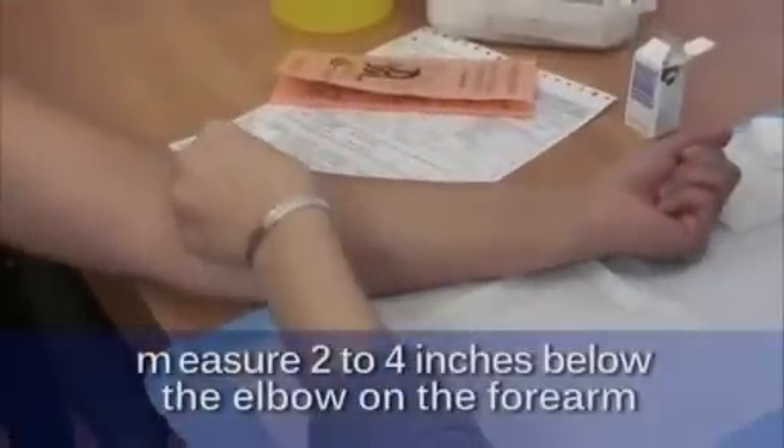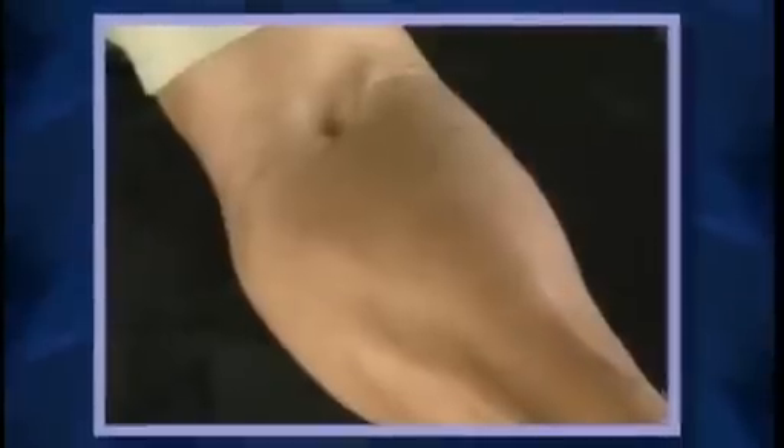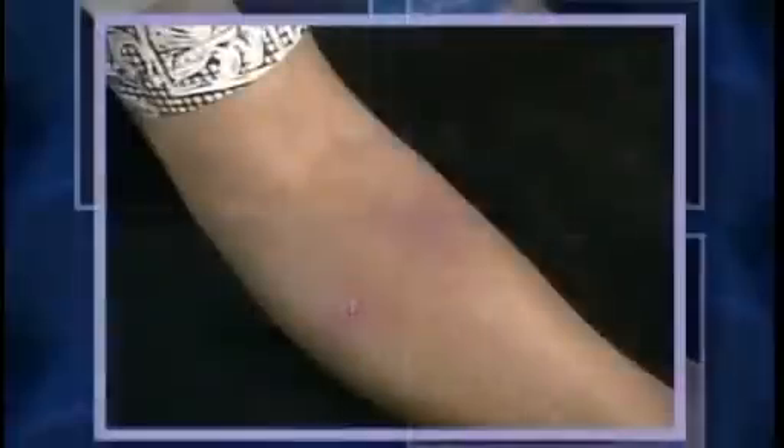Measure approximately 2-4 inches below the elbow on the forearm for the injection site. The area selected should be free of any barriers to placing and reading the skin test, such as muscle margins, heavy hair, veins, sores, or scars.